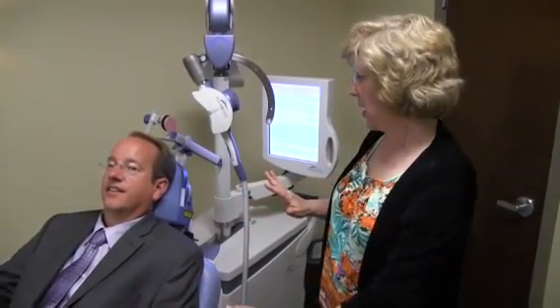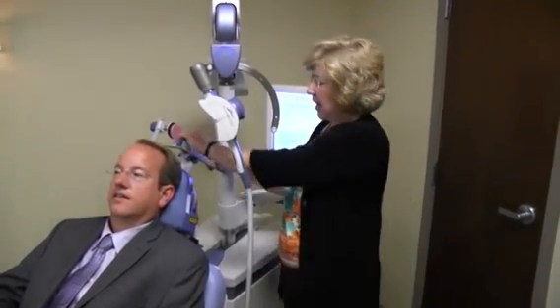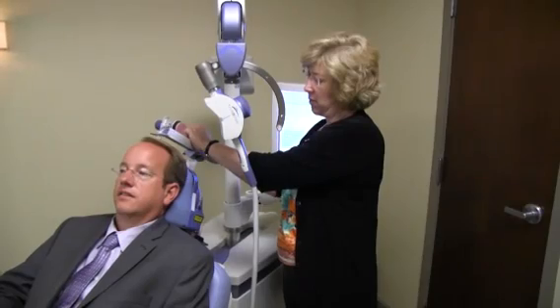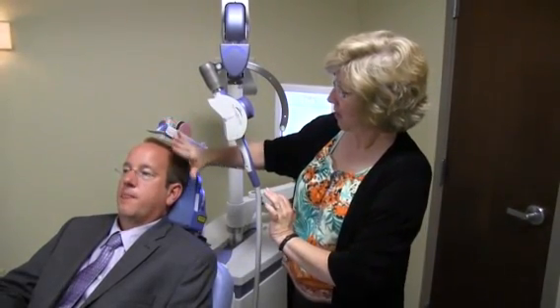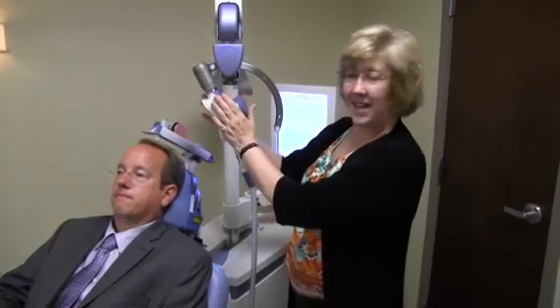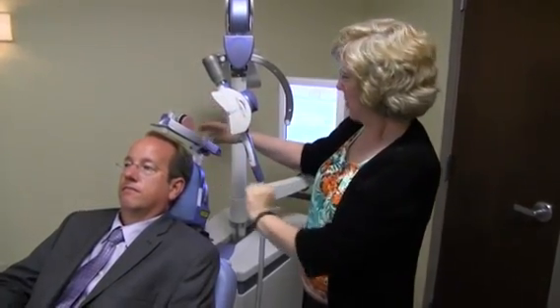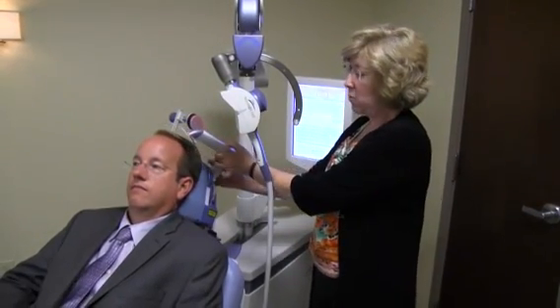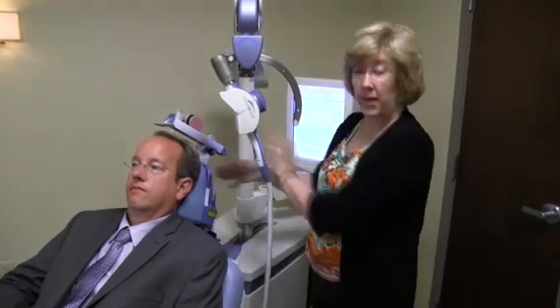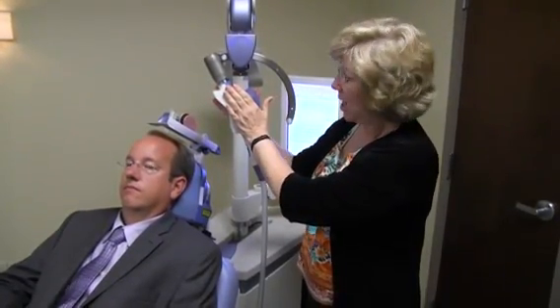After a person reclines, we do a lot of different measurements to make sure things are lined up correctly. And I'm just showing one of them. We measure where the current of the magnetic coil is actually going to go. We do a couple different things there using these different sliders, and then once we have that set up, which I'm not going to go through how we actually do it, we place the coil on somebody's head.